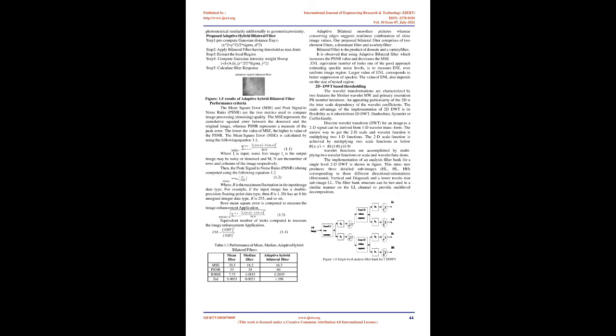Threshold calculation: maxil equals maximum values. Number_bins equals number of histogram bins, mu_t equals cumulative threshold value. Effectiveness metric of mammogram calculated by M equals maxil divided by sum p times 1 to number_bins, dot 2 mu_t2. So effectiveness metric may be used, but for large scale processing of mammograms computational complexity may increase.